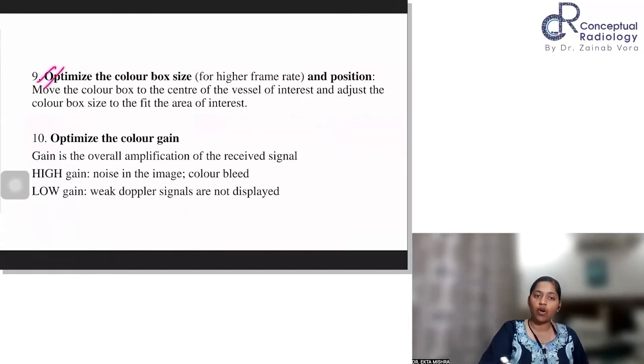So after that, you have to optimize the color box size. You want to achieve the highest frame rate for that image. And then position of the box. You don't want a big box covering entire screen. You want to focus on a small vessel. So you have to have a bull's eye view. You have to see that image and you have to focus the size of the color box accordingly. So try to move it to the center of the vessel and then adjust the size to fit the area of interest.